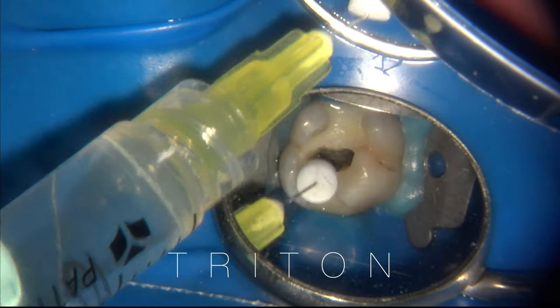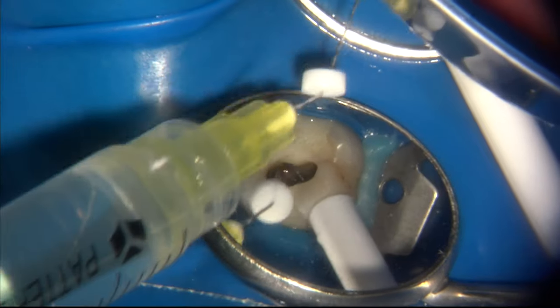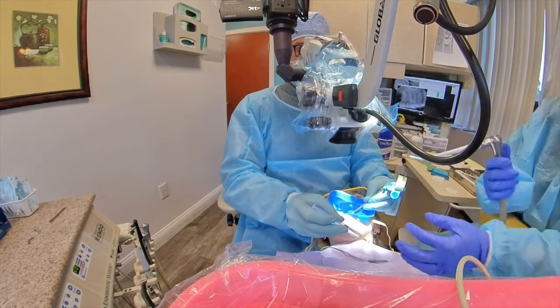Now you add Triton. By adding Triton after debris removal, you are introducing the effects of chelation, disinfection, and tissue dissolution into the canal once the loose debris is gone. This essentially becomes a three-step process when you want to irrigate.